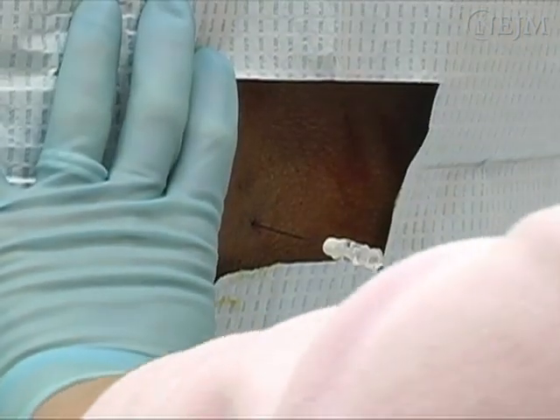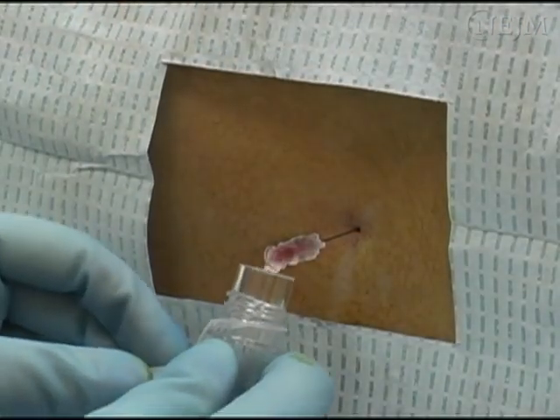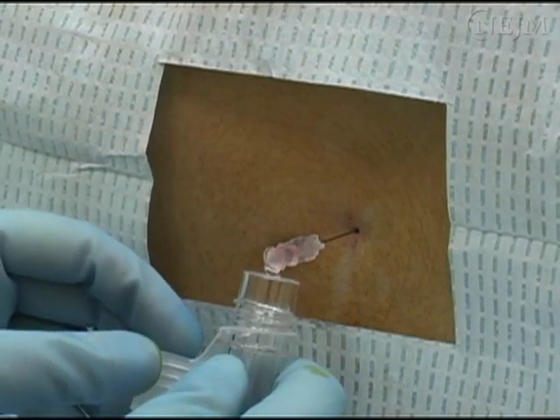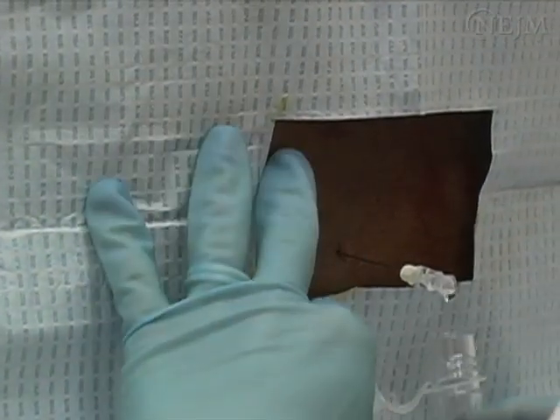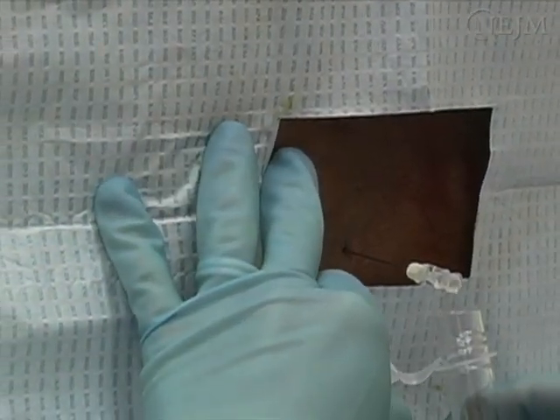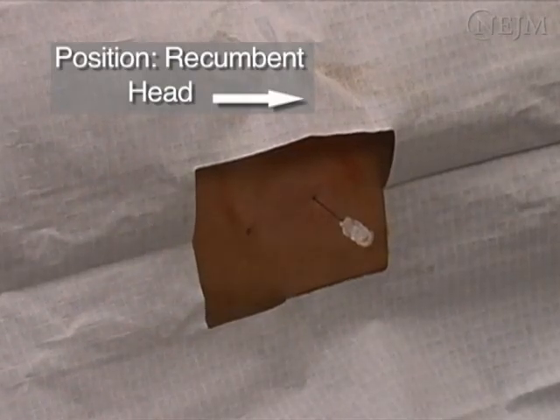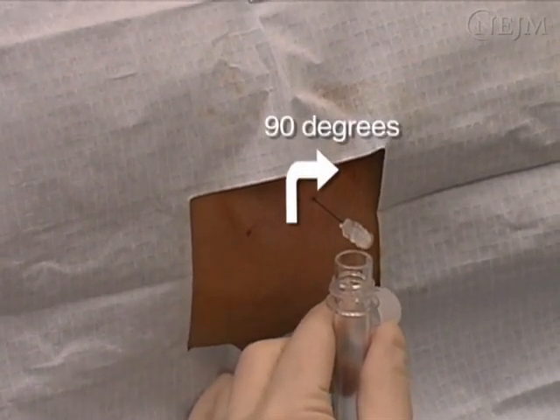Fluid will flow once the needle enters the subarachnoid space. If the lumbar puncture is traumatic, the cerebrospinal fluid may be tinged with blood. As additional fluid accumulates in the barrel, the fluid should become clear, unless the source of the blood is a subarachnoid hemorrhage. If the flow is poor, a nerve root may be obstructing the opening of the needle, and you should rotate the needle 90 degrees.